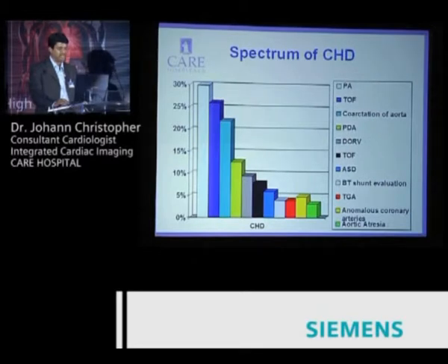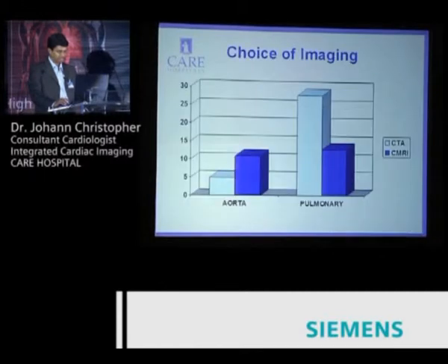And here the RV is the systemic chamber, so sequential MRIs yearly or every 6 months we do them to assess the RV function, which is difficult to do in any other modality. So this is the kind of cross-section that we have.